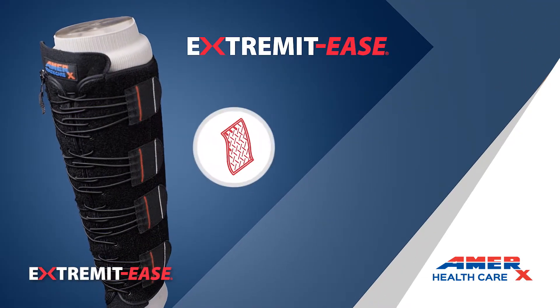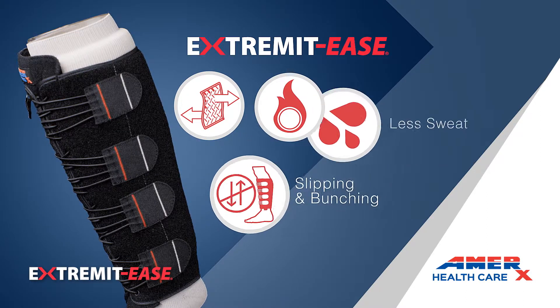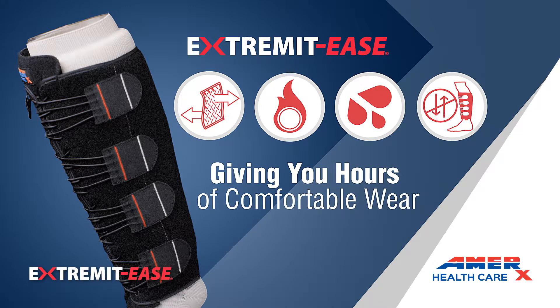Extremides uses lightweight, breathable fabric for less hot spots and sweating, and its design reduces the slipping and bunching often found in other compression garments, giving you hours of comfortable wear.